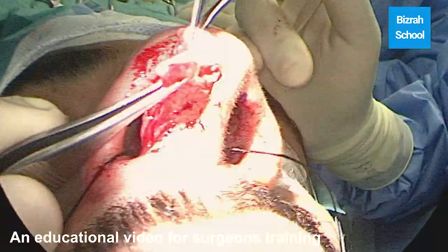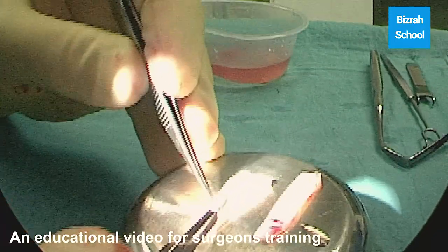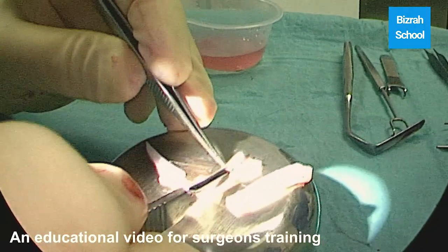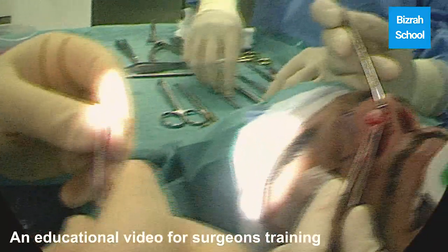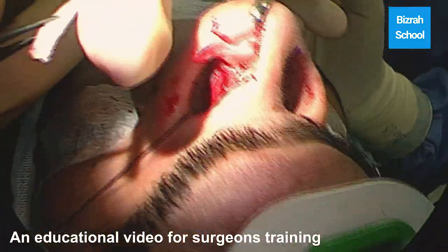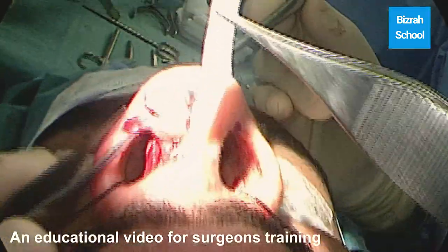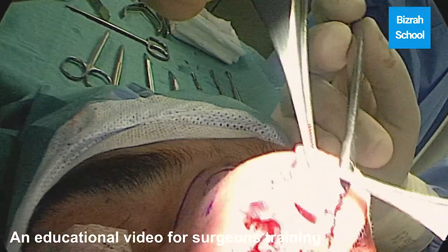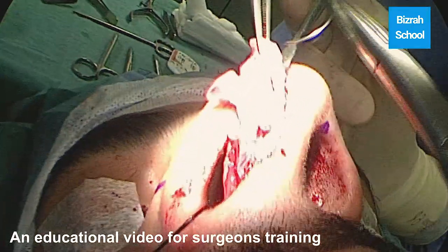And we will go back to our cartilage — one has a low columellar strut, one has a tip graft, one has a midline belt — creating strong structure in the middle, a strong tip.